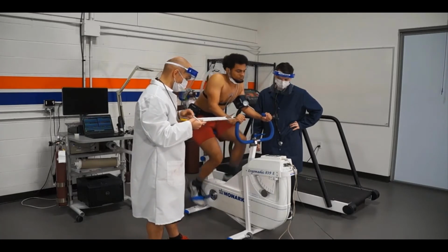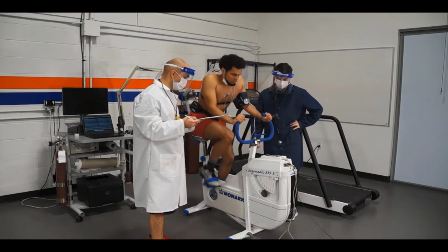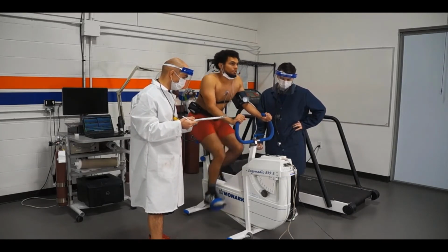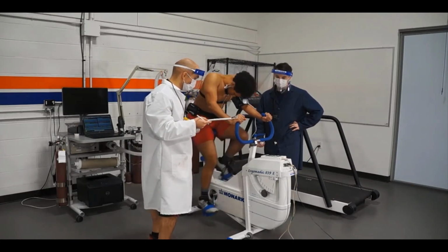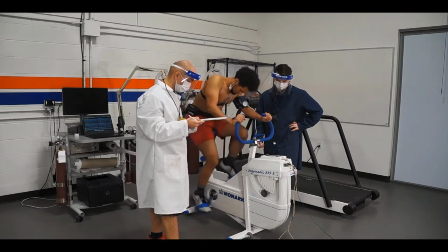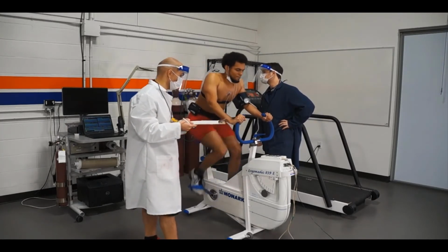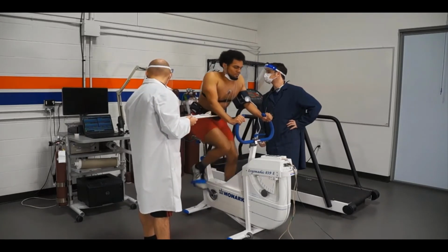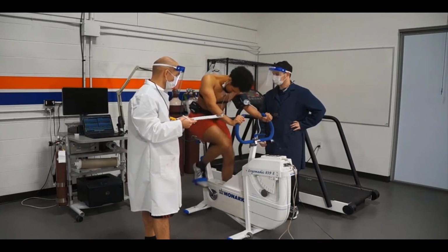There are indirect tests, and I think people typically use these more than direct tests because you want stages in an indirect test to plot those data points. You are taking the person to a workload where you will have an end data point and an end heart rate. You're not doing predictive analysis like a submax test is doing, but you typically want standardized workloads so they hit steady state, so you have that solid data point to plot.